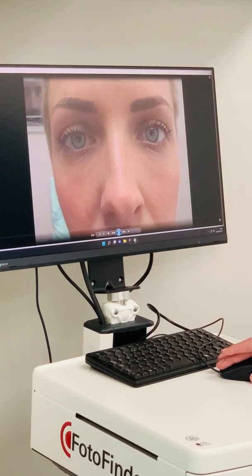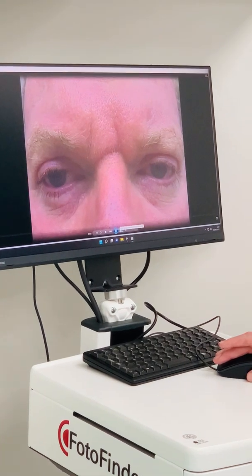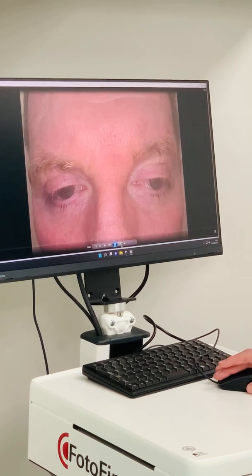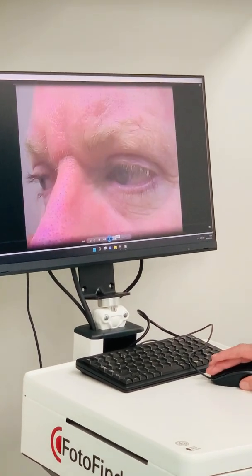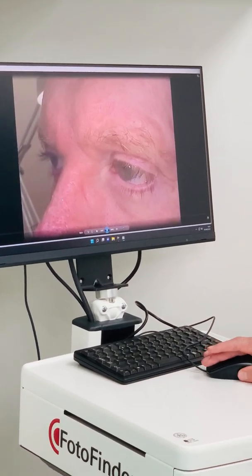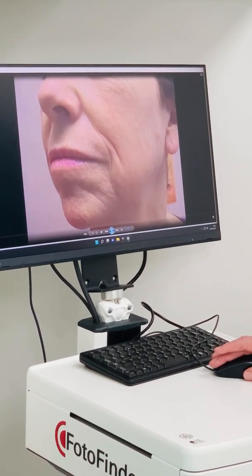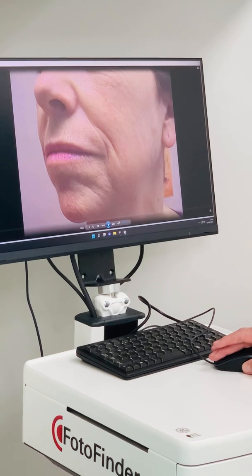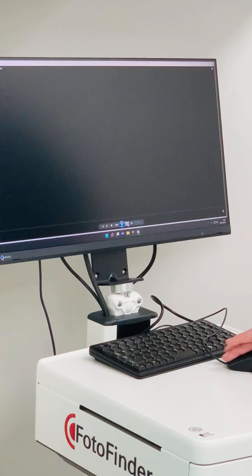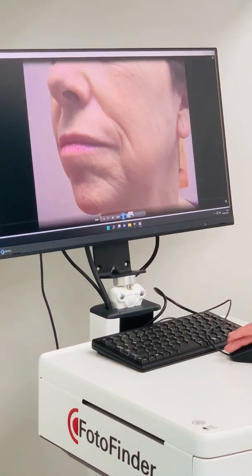Another patient I did, just to show, was this man, and you can see he's been married for a long time. He doesn't look happy, and we did some filler in his frown, and he told me that even his wife was happy about that. There you see him from the side profile, that's before, and then we did a bit of filler on him and he looked much happier. Another patient, again you can see we've got a deep nasolabial fold, difficult to remember how bad it was, and she came back later and we could show her that it was looking much better. I'll just go back one, the deep fold, and then that.